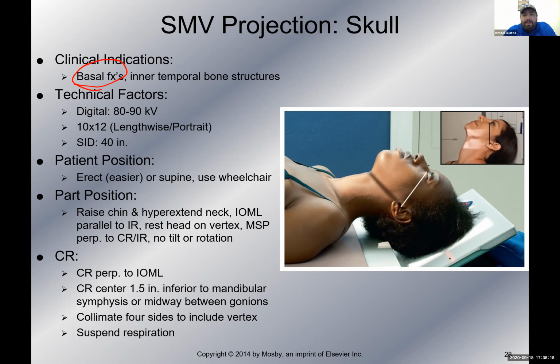Now, this position is very difficult for the patient to hold, so you need to make sure you have everything set up first before you do this projection. Make sure you have your tube aligned at the distance and your technique set up, all that, before you start positioning the patient, because they're not going to hold it for very long.